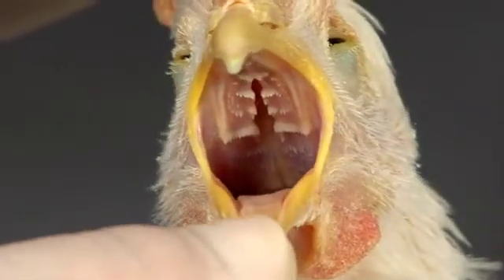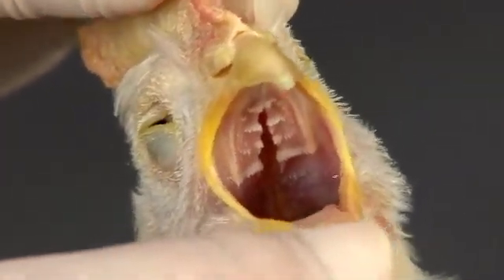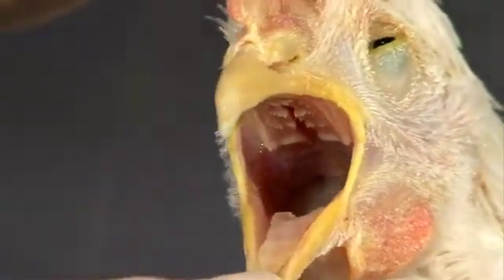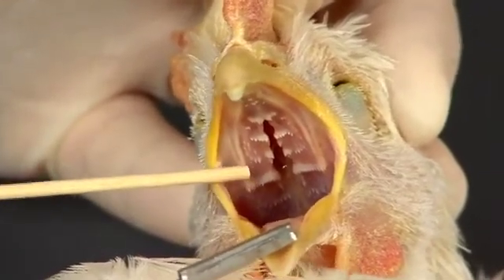Inspect the oral pharynx for any lesions. Note that birds do not have a soft palate or a discrete boundary between the oral cavity and the pharynx. On the roof of the oral pharynx is a fissure, called the choana, which opens into the nasal cavity. Inspect the area around the choana for ulcers.